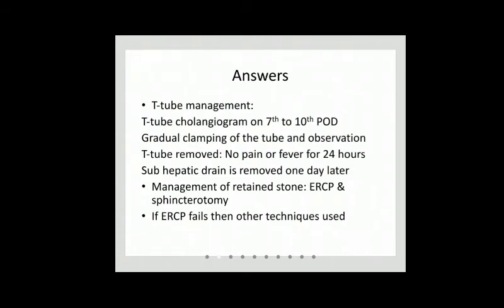But if you put it like that, it may be benign jaundice or malignant jaundice. So what are the benign causes of obstructive jaundice? CBD stone, postoperative strictures or inflammatory strictures. Yes. So the most important benign cause is the stone in the common bile duct.